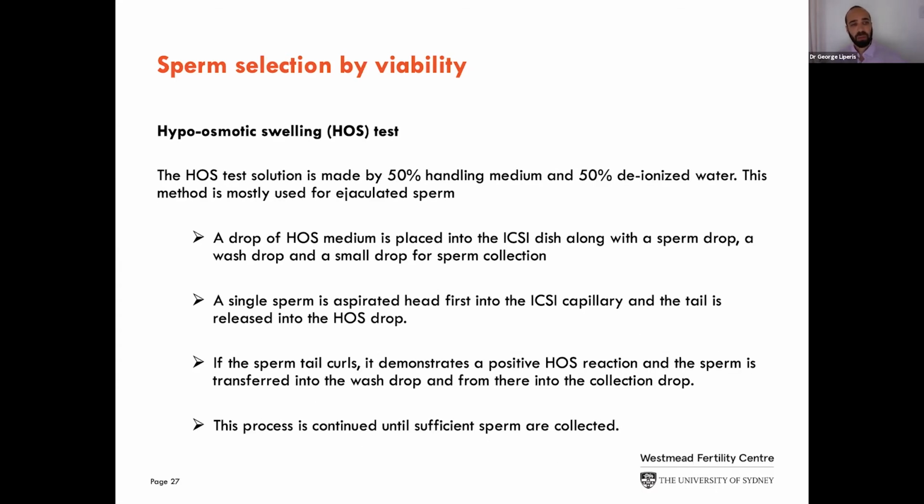We also have the hypo-osmotic swelling test, in which the HOS test solution is made of 50% handling medium and 50% deionized water.